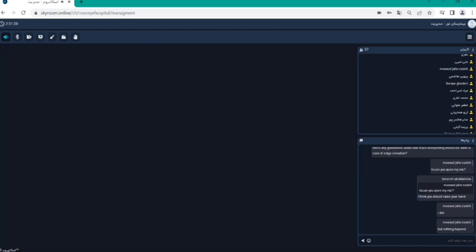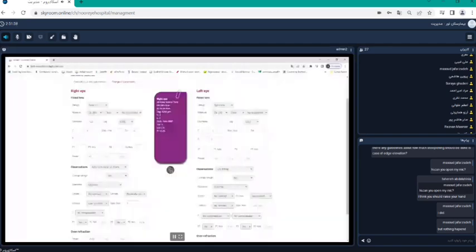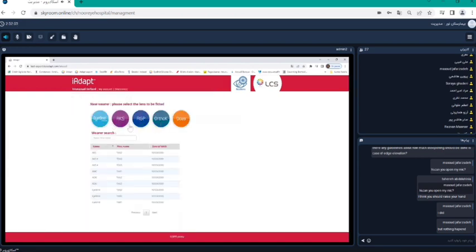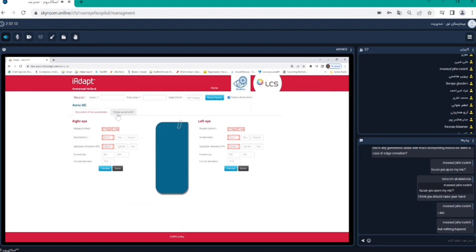I can show you right now with the software online. So I need once again to change the screen. Okay, yeah. So I am once again online. So I go home here. If you wish to fit an ortho-K lens, you just press ortho-K. And what is interesting is that you can have the calculation of the ortho-K lens automatically. I go quick on that. You just have to specify the parameters of the patient here.